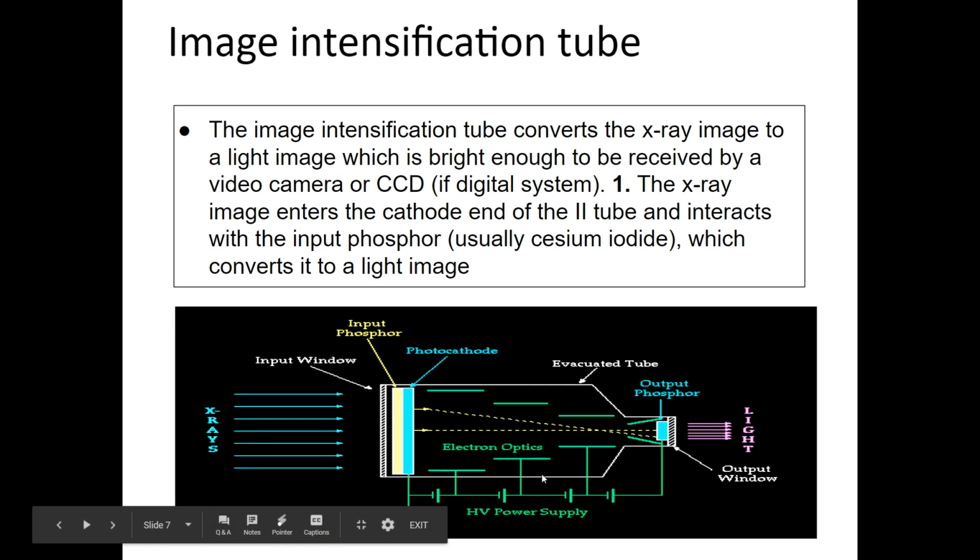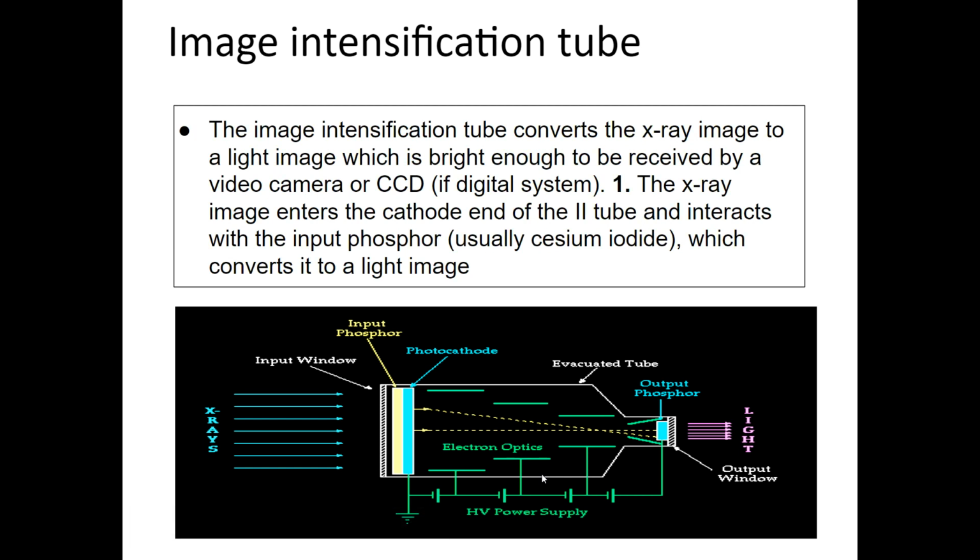So here's the fun stuff. The fluoroscopic tube or II tube kind of looks like a milk bottle, similar to an X-ray tube in that you have a cathode side where things start. So we start at the left and we move to the right, and then you have an anode area down here. And in particular, I tried to take an image that's not in your book, although the one in your book should look almost the same. Theory is that on the registry, you don't know who the artist is going to be. So you kind of have to know what these things are.